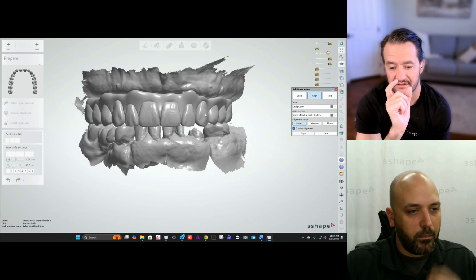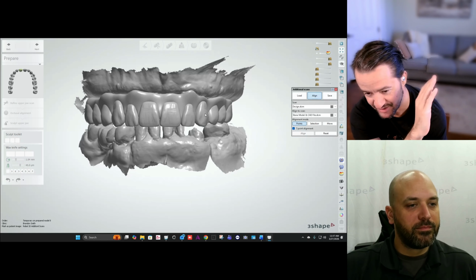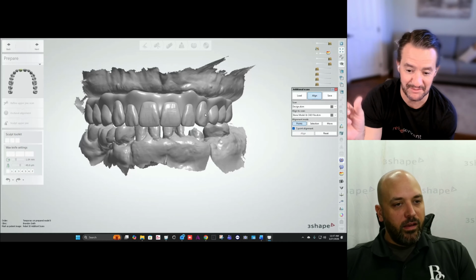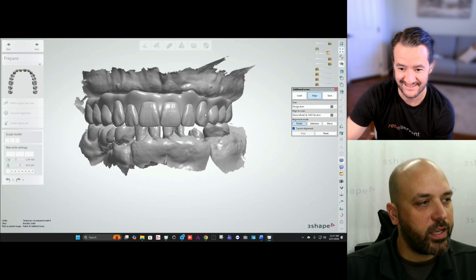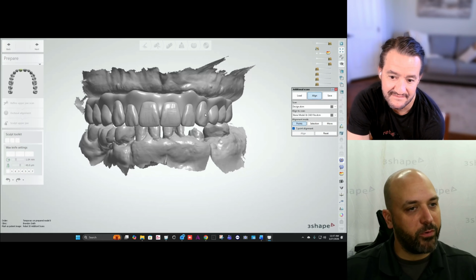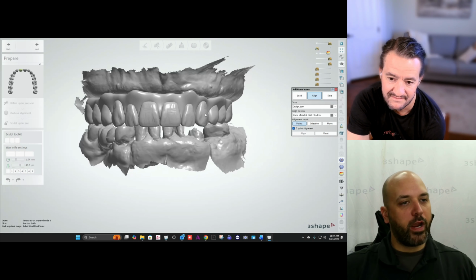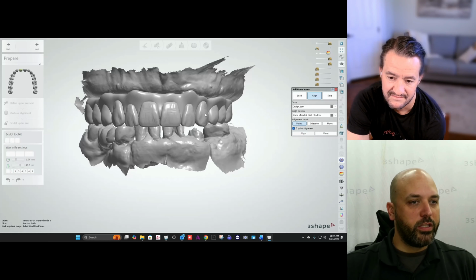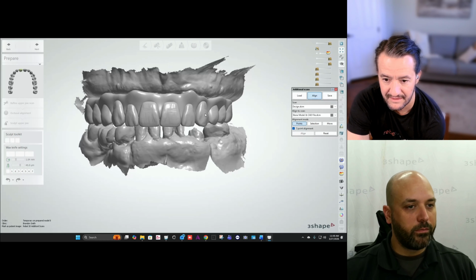So by doing this, you spent how much time mentally preparing for aligning all of these scans, and then you saved how much time by not having to design from scratch again? Yeah, this whole process to do this alignment and rename these scans is maybe 5 to 10 minutes worth of work. As long as you know which cases you're pulling things from and where those other scans are coming from, it's really simple to do. You really just need to be able to get that original CAD file aligned to the new scans. That's really all you have to do.